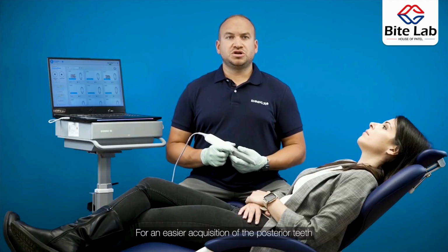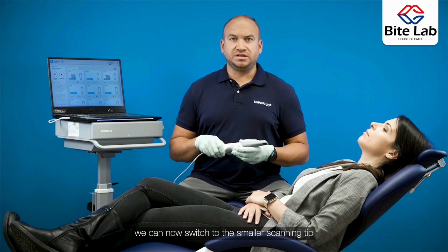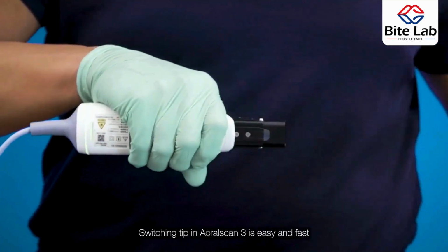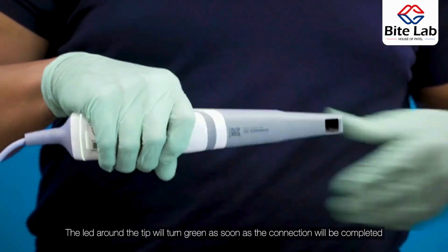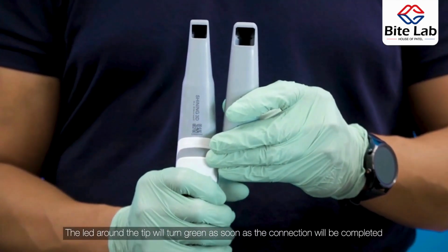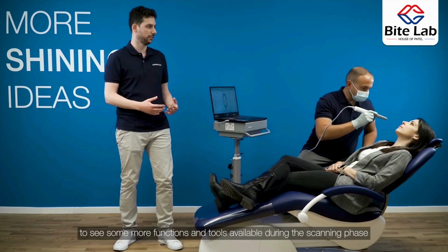For an easier acquisition of the posterior teeth and to ensure more comfort for the patient, we can now switch to the smaller scanning tip. Switching tip in Aoralscan 3 is easy and fast. Dentist or assistant just have to unplug the tip and connect the new one. The LED around the tip will turn green as soon as the connection will be completed. Let's move on to the next step, to see some more functions and tools available during the scanning phase.